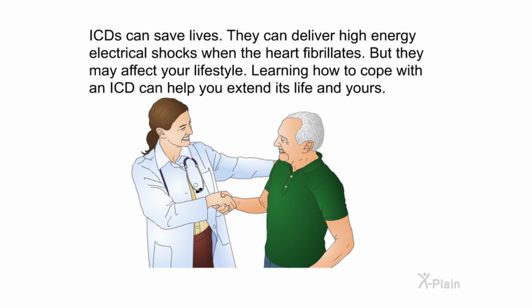ICDs can save lives. They can deliver high-energy electrical shocks when the heart fibrillates, but they may affect your lifestyle. Learning how to cope with an ICD can help you extend its life and yours.